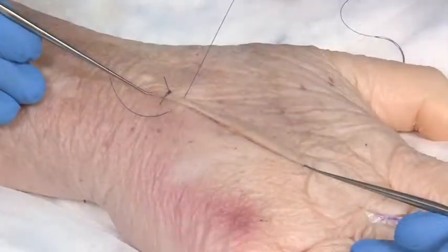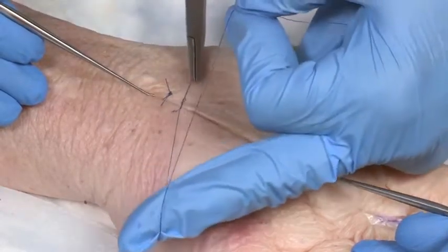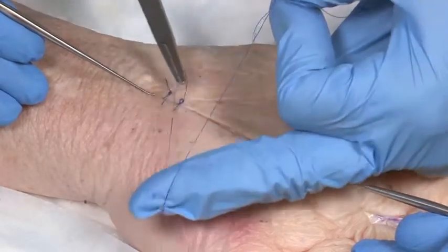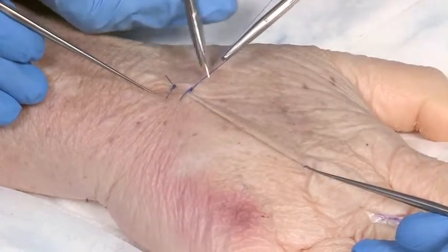In order to perform an instrument tie, double loop one end of the suture around the needle holders, pick up the short end with the needle holder and pass it through the double loop. Repeat this, moving the instrument and your hands in opposite directions with single loops.